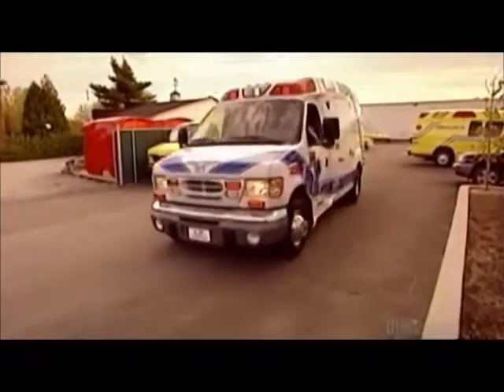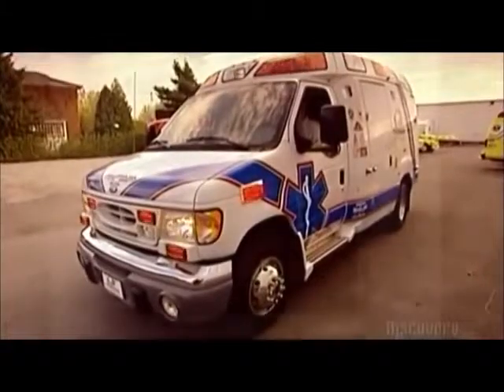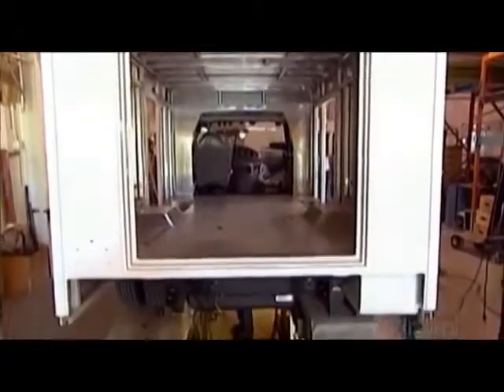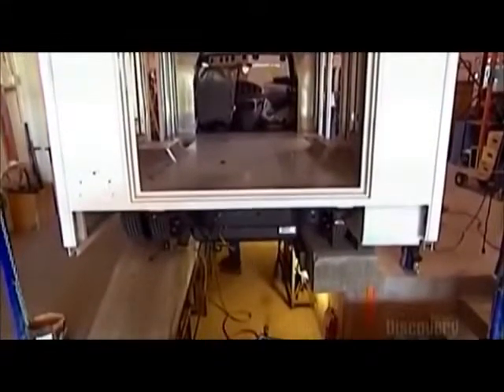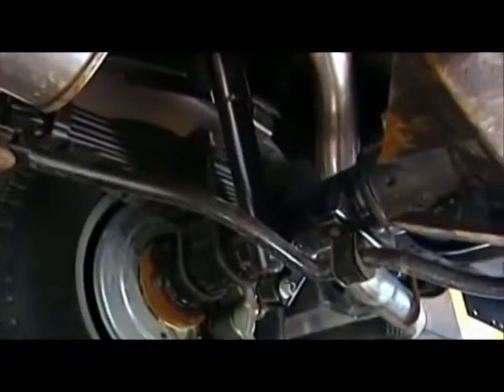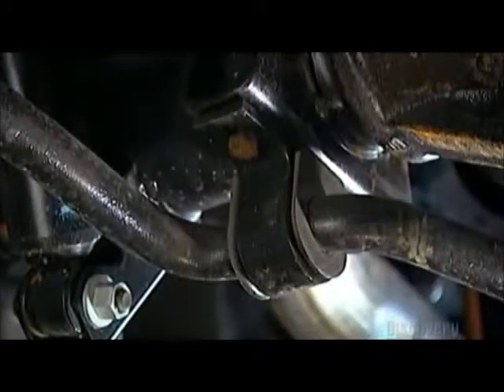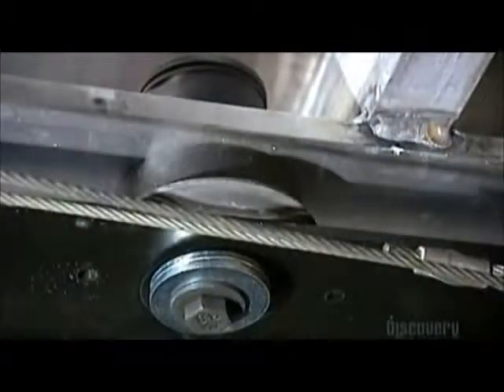There are three types of vehicles commonly transformed into ambulances: minivans, trucks with a closed driver's cab, and trucks with an opening between the driver's cab and the back storage area, like this model. The most important structural addition is a stabilization bar to diminish rocking when the vehicle is racing at high speed. Otherwise, it's mostly a question of retrofitting a regular vehicle to give it the features an ambulance needs.